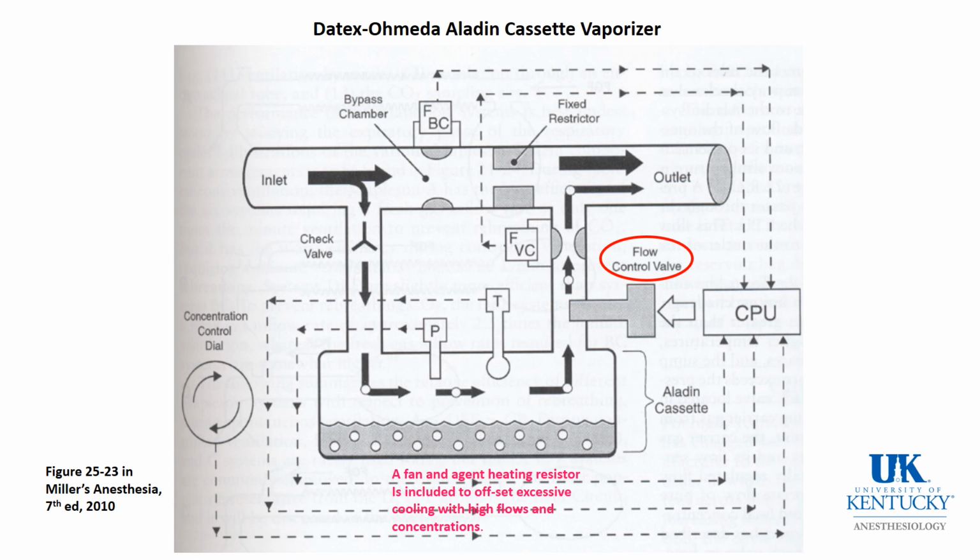What is unique is when you plug the cassette in, and there are separate cassettes for each type of vapor, each type of anesthetic agent. When you plug it in, the computer recognizes what vapor there is. It also measures the temperature and measures the pressure in the chamber and does all the calculations to adjust the valves so that it generates the proper output.